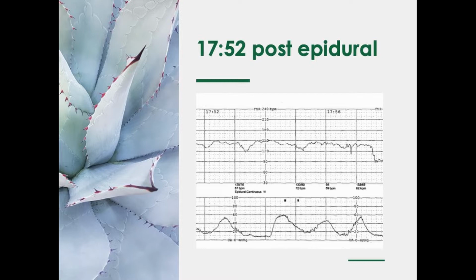So I'm going to go over those definitions again. I'm going to throw them up on the screen. This does look like a V. It is a 15-point decrease below our baseline of 145. It is a sharp drop-off, so you can call that a variable.